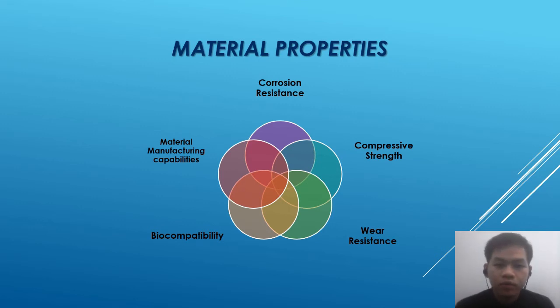Raw material proposed for the product on knee prosthesis, biomedical surgical implant has a resistance to corrosion. Corrosion resistant is one of the essential material properties because corrosion inside the internal part of our body will cause some damage or harmful reaction.